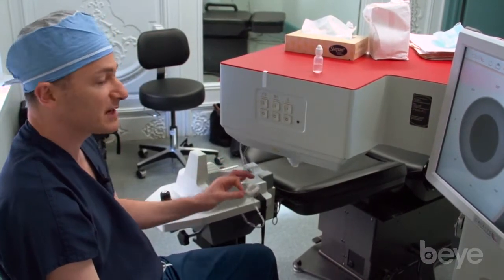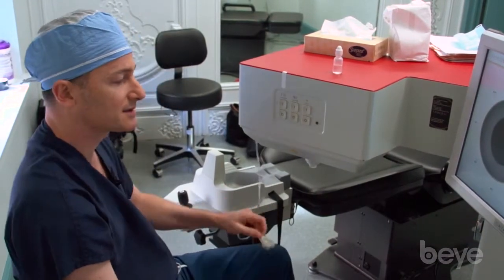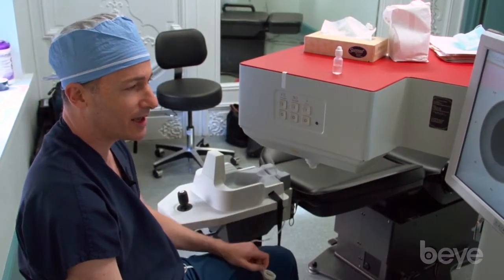The pressure rise is very minimal with this interface, and it's comfortable. We operate on patients of all ages, so we want to minimize any trauma or any high IOP.